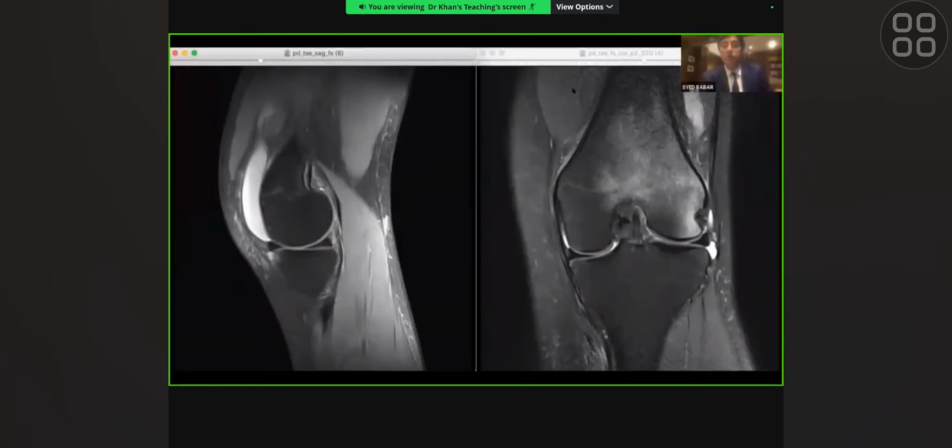And I'm going to give you the control. Have you got it? Yep.